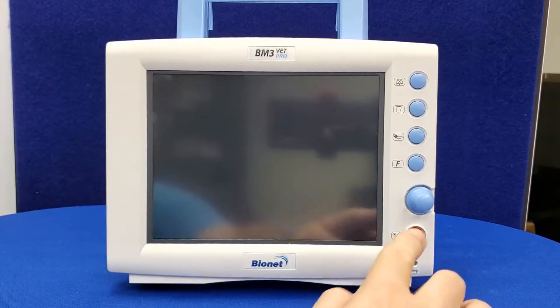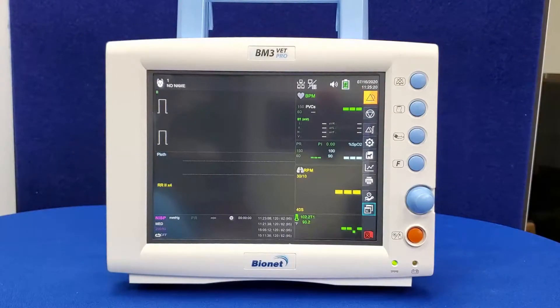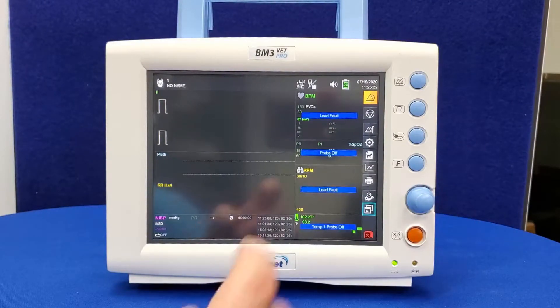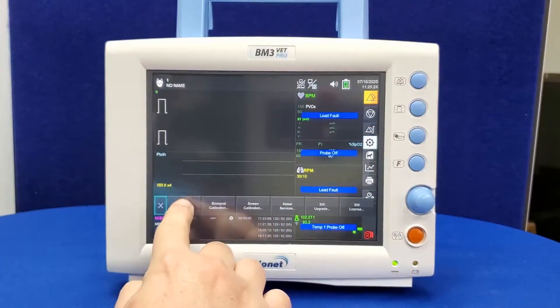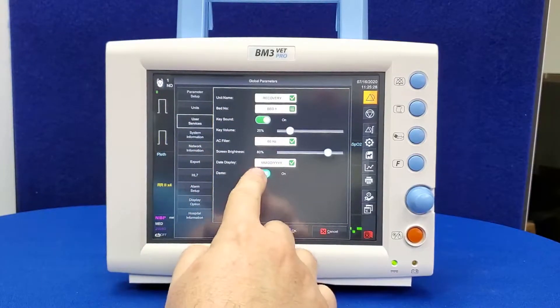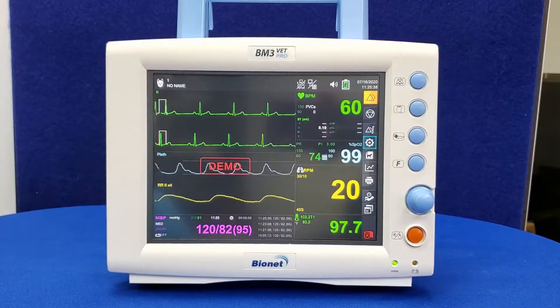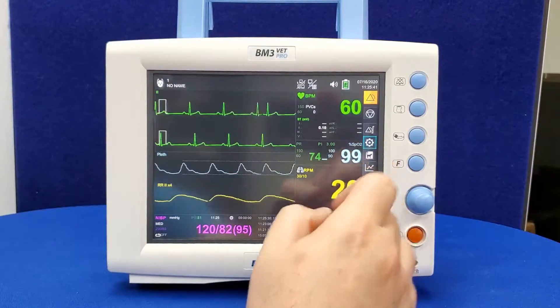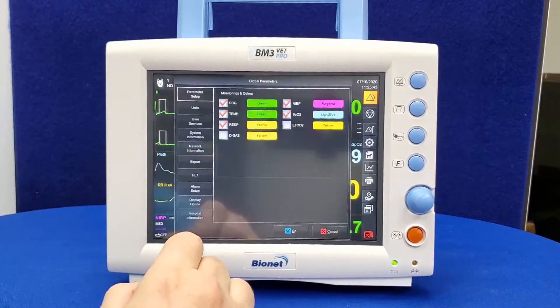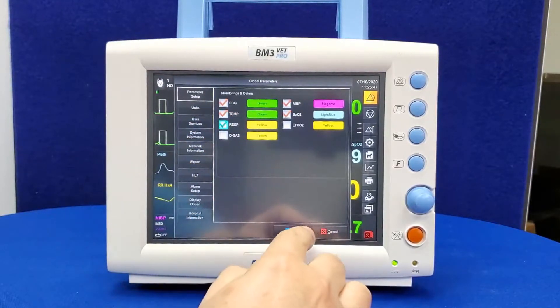To turn on the unit, hold the power button for at least three seconds. The unit will power on to the parameter screen. Let's set it in demo mode to see what parameters will look like under normal usage. You will see the screen divided into waveform readings and numerical outputs. You can customize the display of parameters by selecting the gear icon, then Setup, and checking or unchecking the desired parameters. This feature will help clean up your display to best fit your practice.